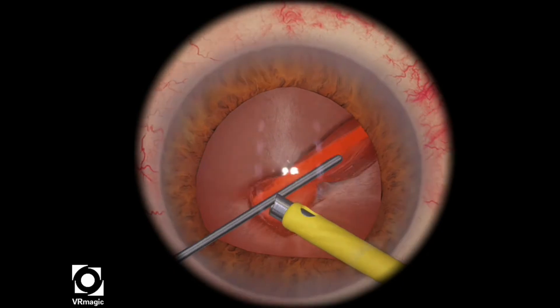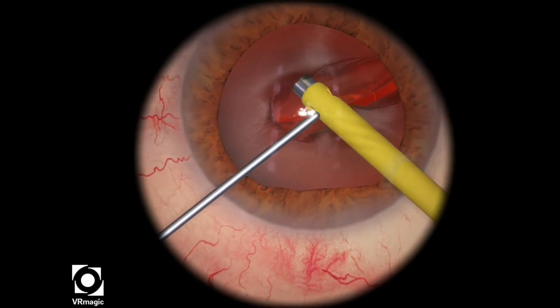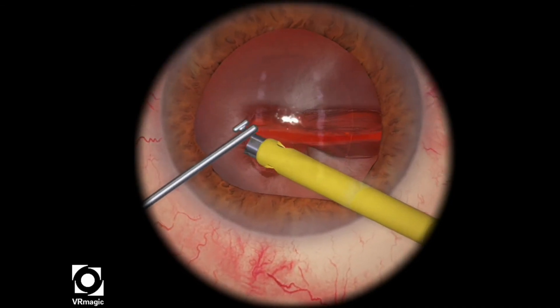My tip for this one is to dig a very small trench, kind of what I did at the start of this video, and then propagate the crack.